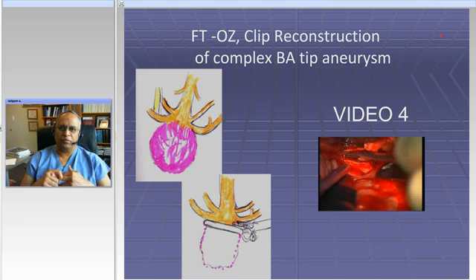And nowadays, what I'm also doing is adenosine-induced transient cardiac arrest in some complex basilar tip aneurysms. In addition to the temporary clip, I'll use it for very short periods of time. It gives you very transient arrest, anywhere from 30 seconds to 1 minute. But of course, you have to prepare the patient preoperatively. The anesthesiologist must be on board. The patient must be healthy, etc.